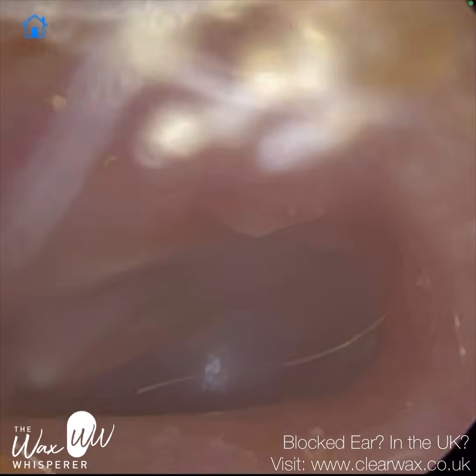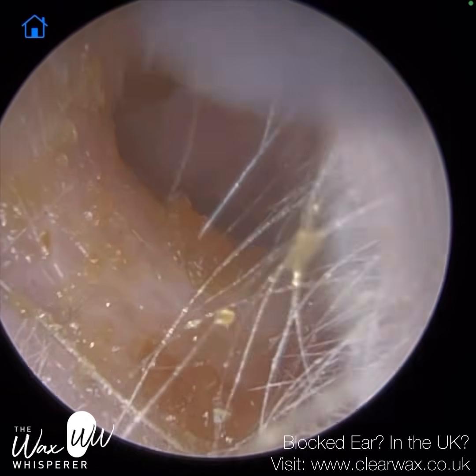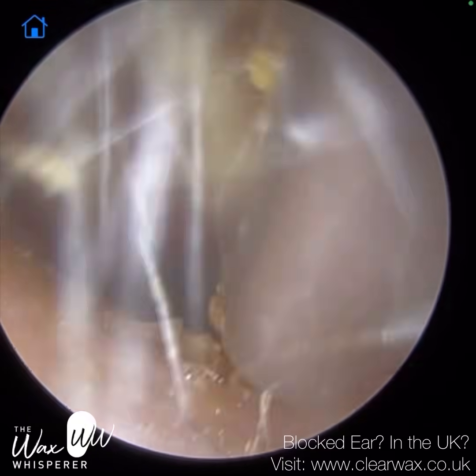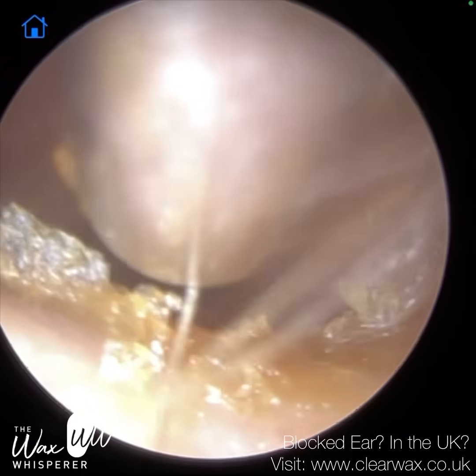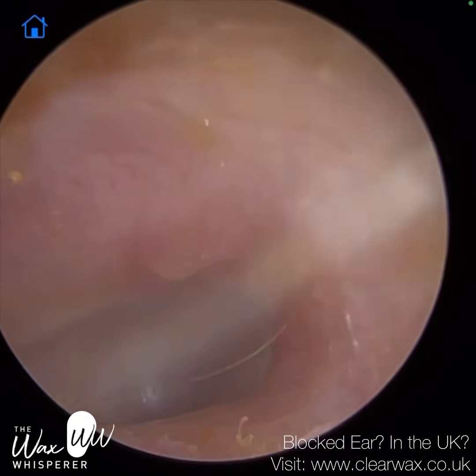Now this patient has got a small bony spur on the posterior canal wall. You can just see it there, I've just zoomed in. It's nothing to be concerned about. If it's soft, then we need to get that further investigated, but it's probably just a small osteoma, which is just a bone spur that sometimes can develop there.